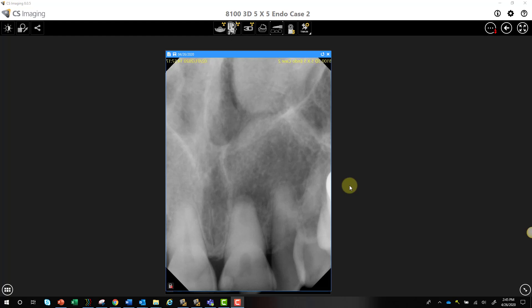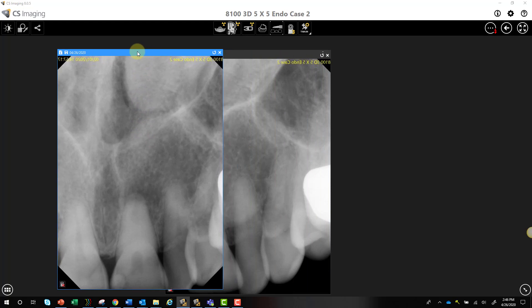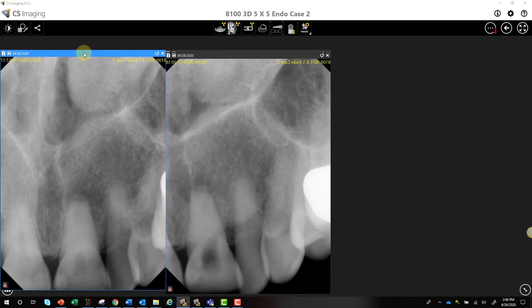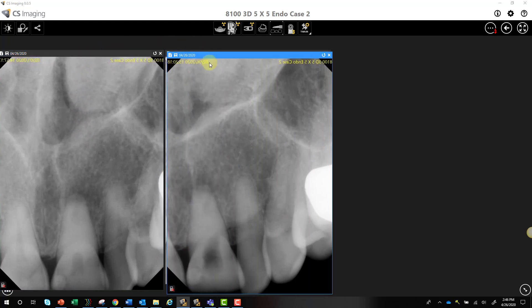So here's the initial PA — it's not a CareStream intraoral sensor. This case started off at the general dentist, and you can see there's a radiolucency here. We can also see that the canal is actually calcified, or at least partially calcified. We can see the chamber here, and they started their access. They lost their way a little bit and really couldn't find the canal, so they eventually decided to send the patient to the endodontist.